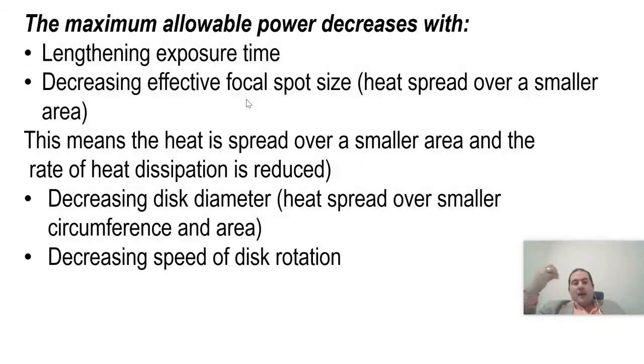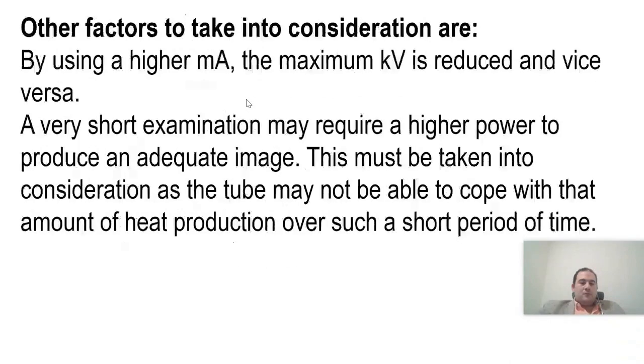It means it's the same indication. It's the same idea, you understand? I mean, when you tell me today to think about the focal spot size, it will be small. This is also an indication that your actual focal spot size is small, not large.